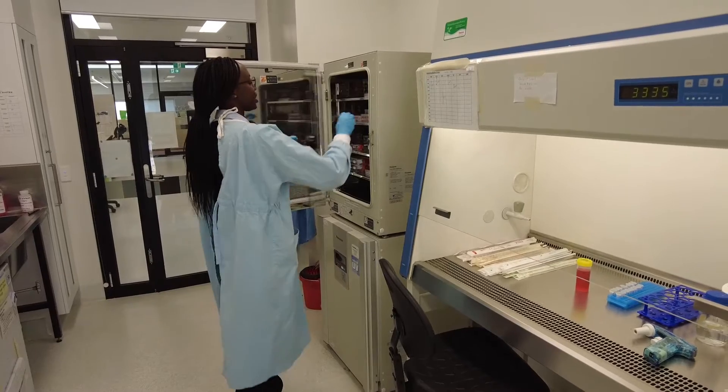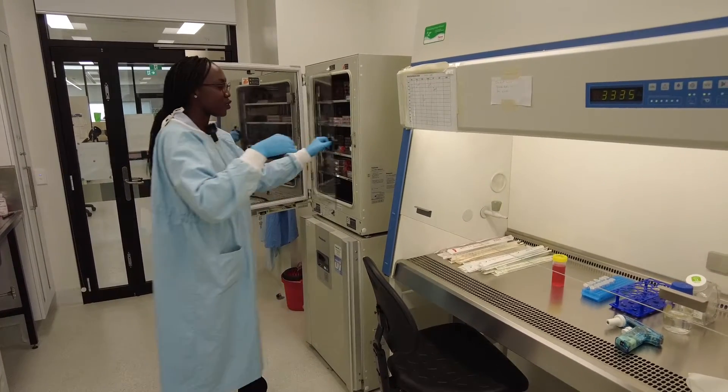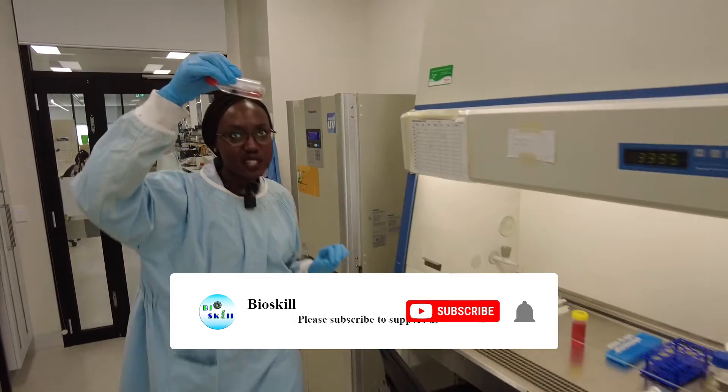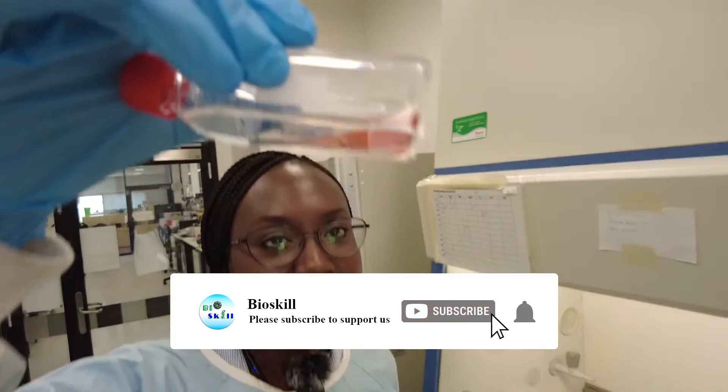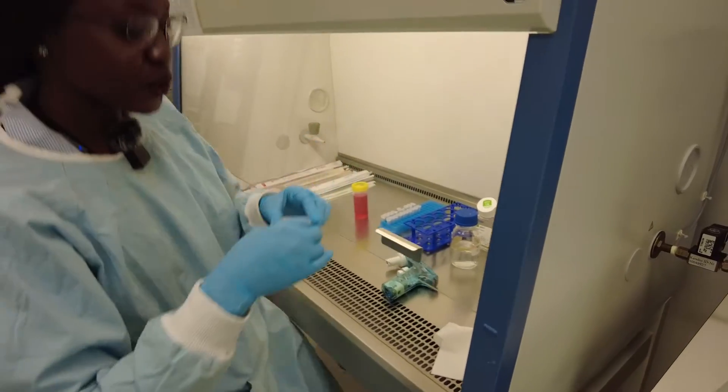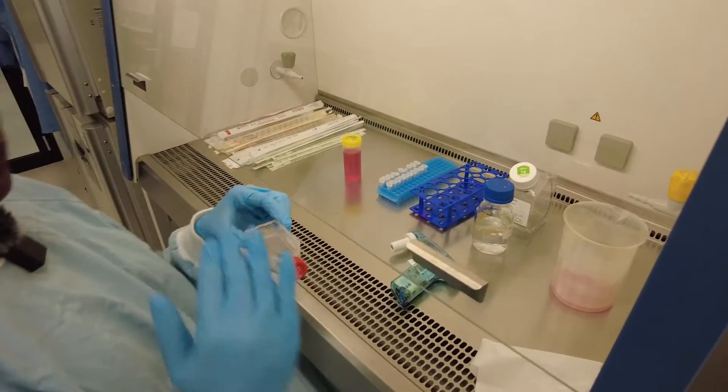Today we're going to change the media of our normal colon cells in the small flask. As you can see, the media is still a pink color, which is great — it's starting to change to orange but not yet. So today we're going to remove this old media and put new media.